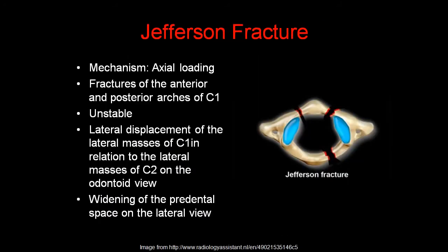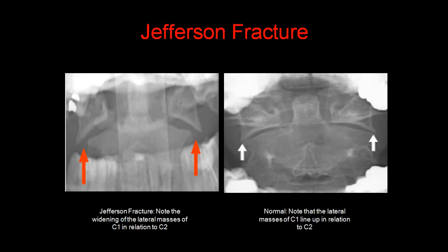A Jefferson fracture occurs because of axial loading. These are fractures of the anterior and posterior arches of C1, and are considered unstable. There is lateral displacement of the lateral masses of C1 in relation to the lateral masses of C2 on the odontoid view, and widening of the pre-dental space on the lateral view. Note that there is widening of the lateral masses of C1 in relation to C2 on the odontoid view, compared to a normal relationship on the right.